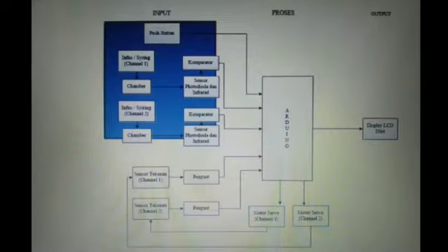Make observations about how the process finds the value of the flow rate in the 2-channel Infusion device analyzer using a photodiode sensor. Planning assembling. System block diagram.